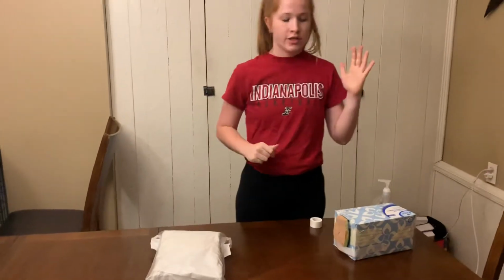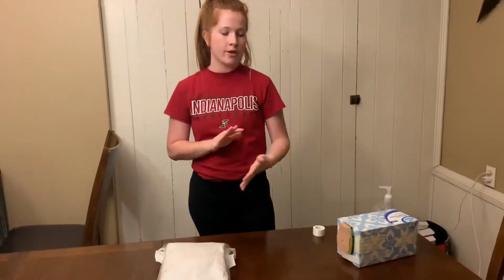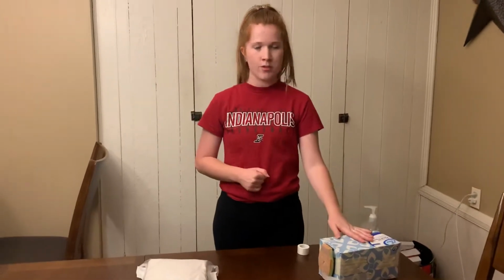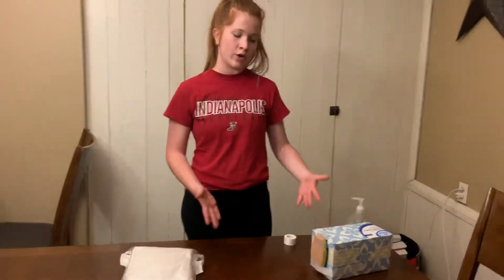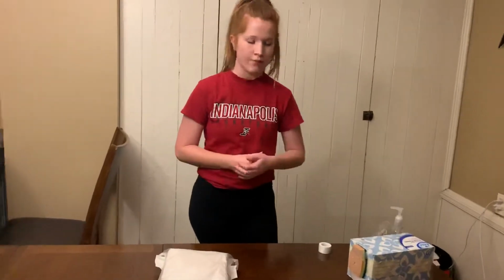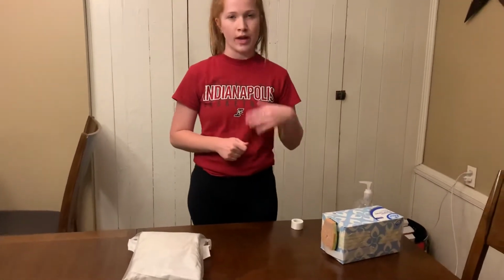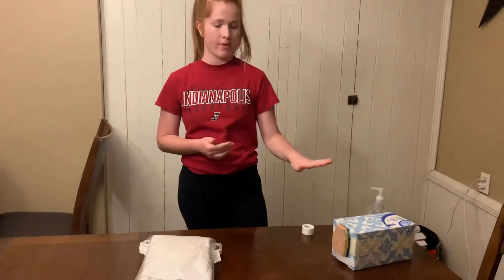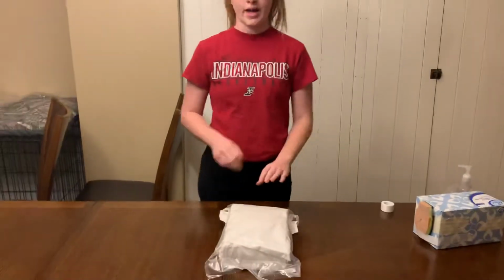Okay, so now that I've explained the procedure, I've let them know what they can do to help me. I'm going to position them into the best position to place the catheter. I have a female patient today, so I will need her to lay supine with her knees flexed, her feet about 2 feet apart, and her hips rotated out just slightly. Now that she is positioned properly, I would clean the perineal area if there was any gross contamination, but my patient today does not have any. So I'm going to start by opening my catheterization kit.